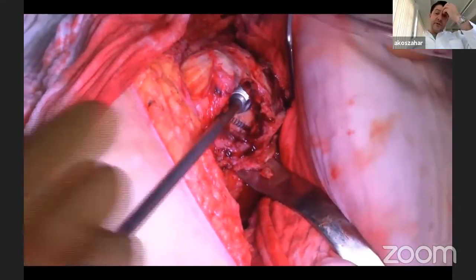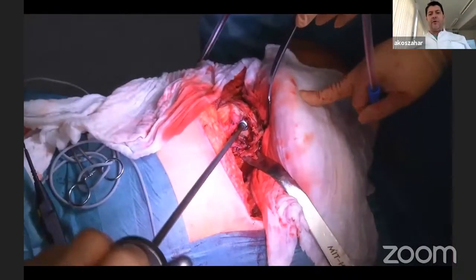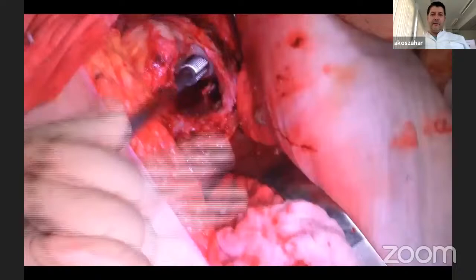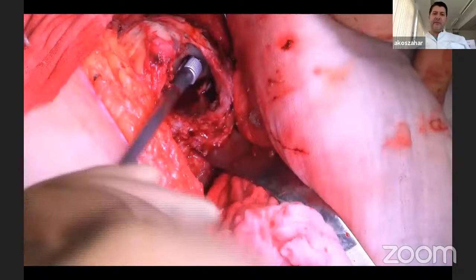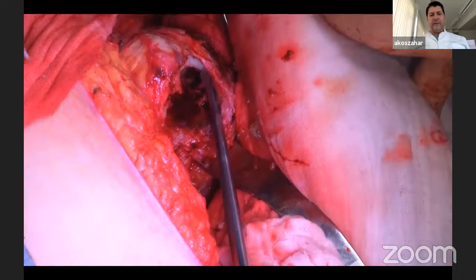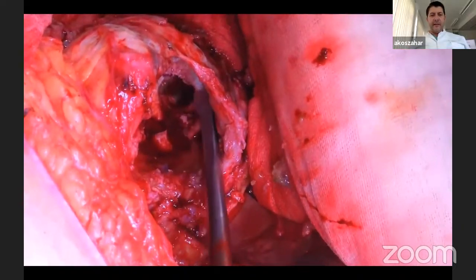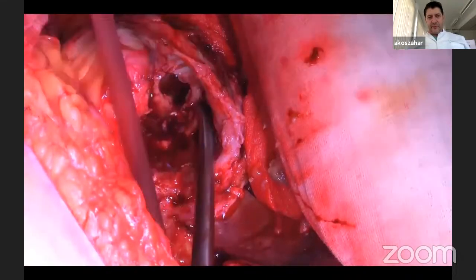I prefer to do it in the endomedullary way, not to do ETO. Of course, if you have a lot of cement and it's difficult to remove from proximal, from the endomedullary way, then you have to go for ETO to remove the implant, remove the cement, remove all hardware in order to debride. But I try to avoid ETO in most cases. You need special chisels, special burrs, special instruments to remove the cement, but it's very important.